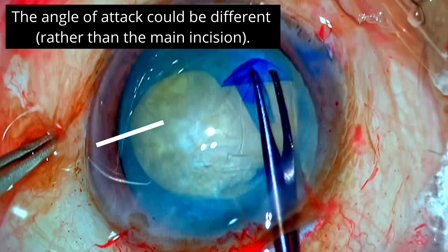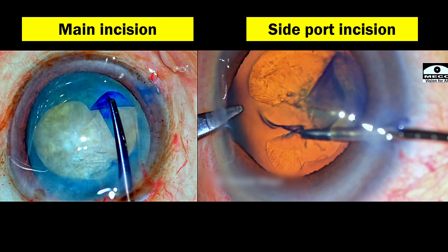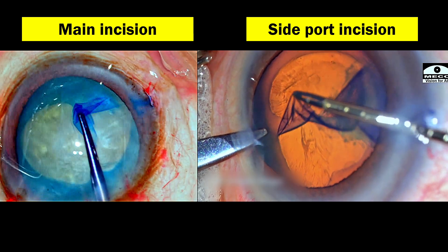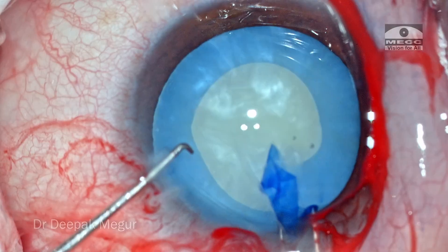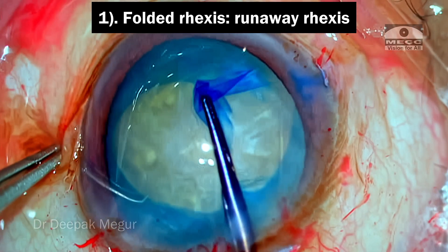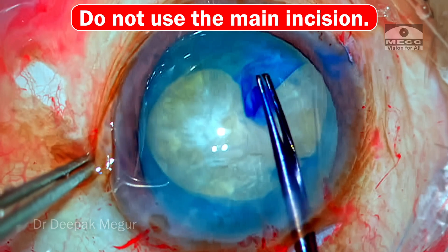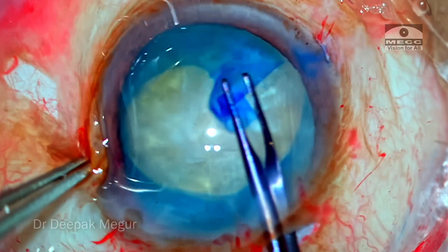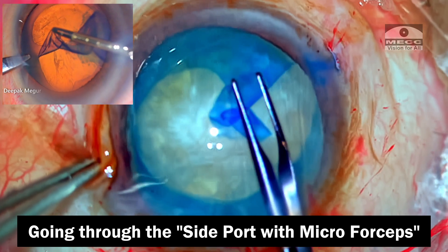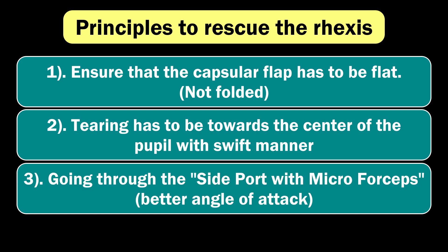Number three: the point of attack could have been different rather than from the main incision. We could have used the side port, gone in with the micro forceps, kept the capsule flat, and then pulled in. Going back and analyzing, the understanding of the technique was not clear — the concept was not so clear. Unless and until we keep the capsule flat and then pull it inside, it won't be successful. If you keep it folded, it's going to run away into the periphery. When attacking, it's always better to find the right angle and not use the main incision, especially when not using OVD to maintain the chamber. Either of the side ports with micro forceps would have been a better option. The change in the angle of attack and the laying of the capsule flat are some of the basic principles one needs to remember.